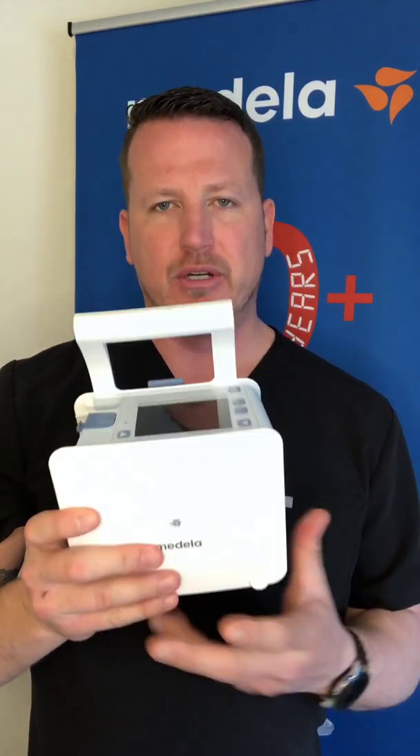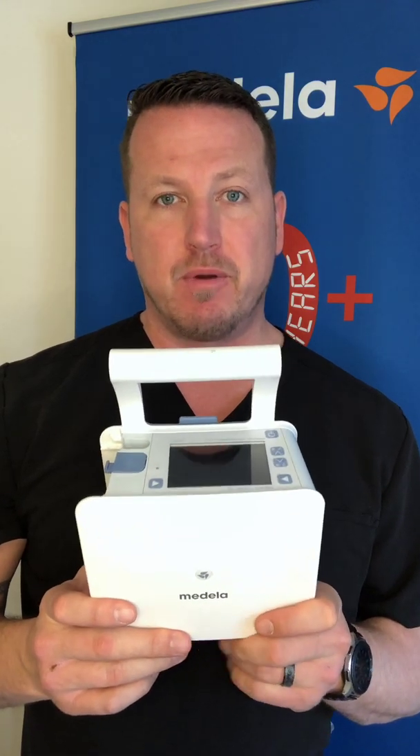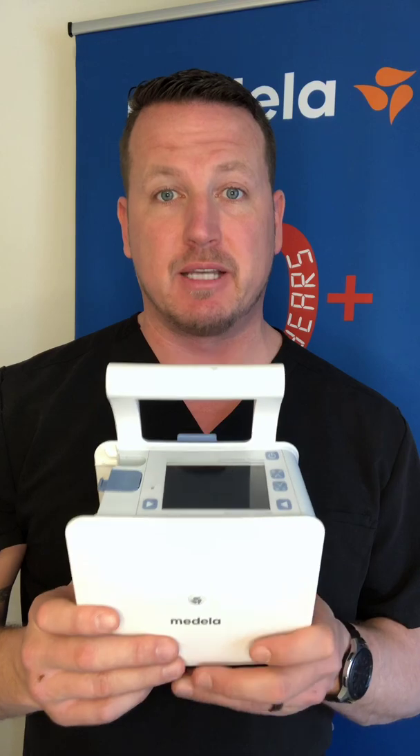Once the device is powered down, comprehensively wipe it down with a disinfectant wipe. Once disinfected and cleaned, return it to the staging area for recharging, reprocessing, and to be available for the next patient. Make sure the rail adapter and power adapter are placed back where they belong for use with the next patient as well. If you have any further questions, please reach out to Medela directly at 877-735-1626.